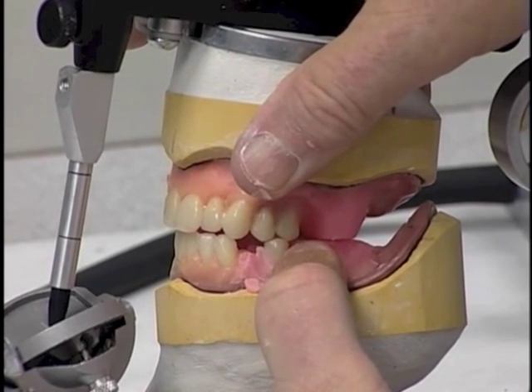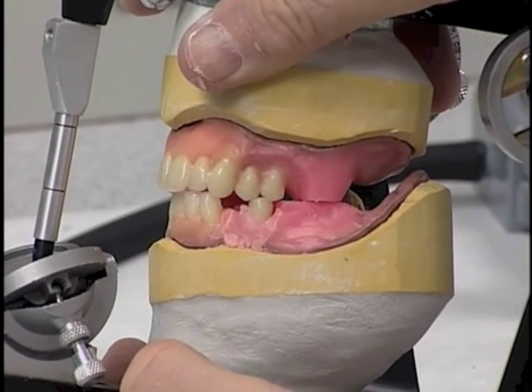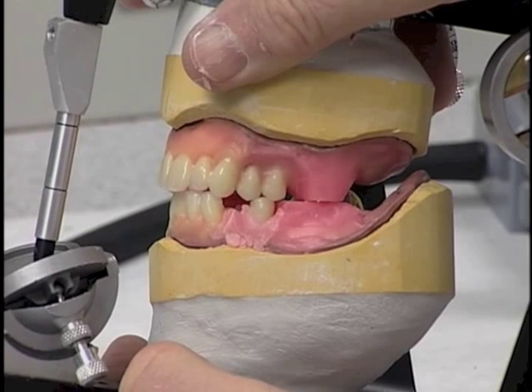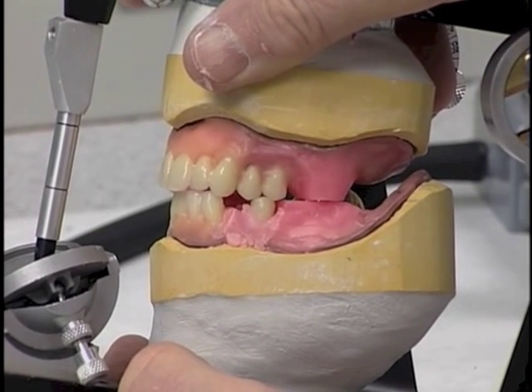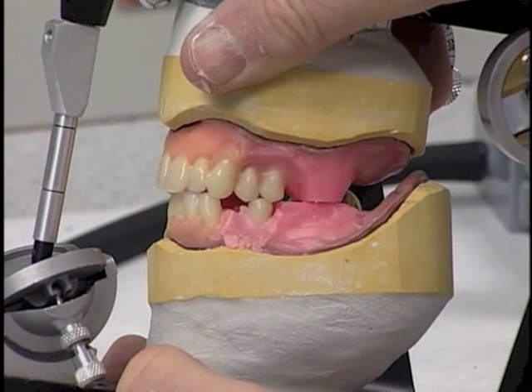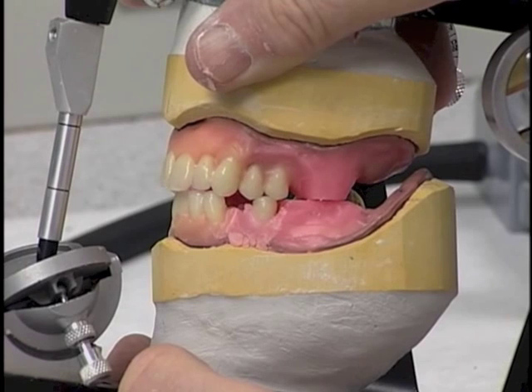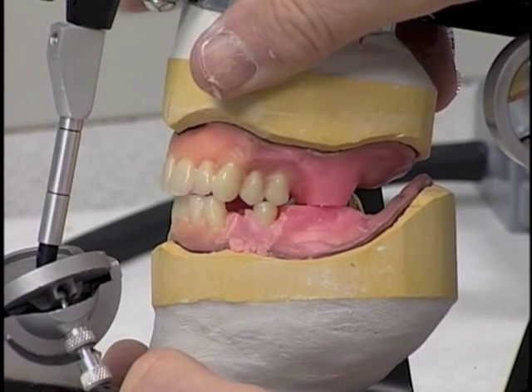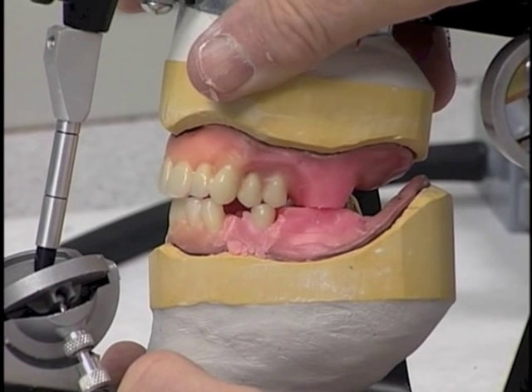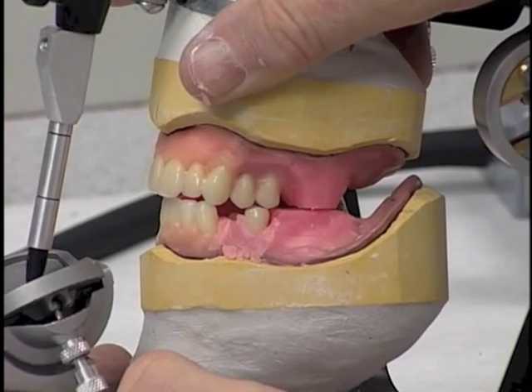Now let's put it in working relation, and what we should see is that the mesial slope of the mandibular second premolar is occluding in working relation now with the distal slope of the maxillary first premolar. And the distal slope of the mandibular second premolar is now occluding with the mesial slope of the maxillary second premolar. That's in working relation, like this.